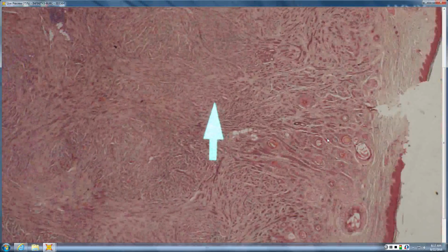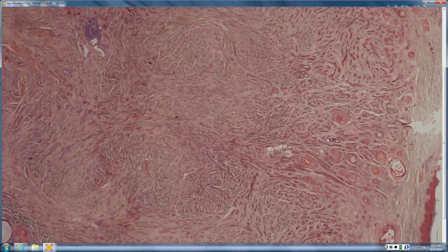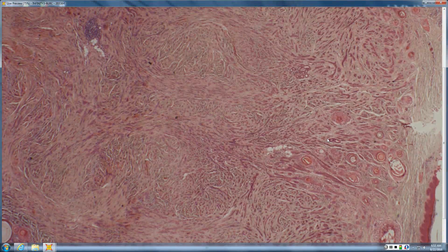So getting back real quick to some other clues: desmoplastic trichoepithelioma should also be pretty small and well circumscribed. Hopefully you have a little dell in the center of it. And then, generally speaking, it's mostly horn cysts and then maybe some calcifications. You don't really see ducts; that shouldn't really be part of it.